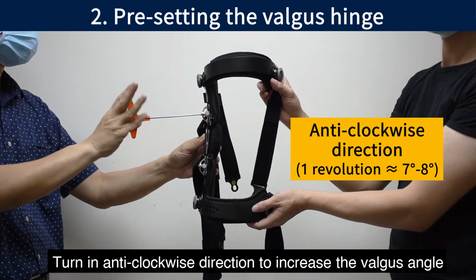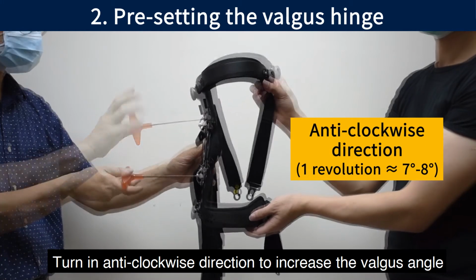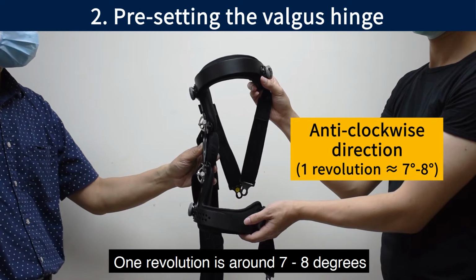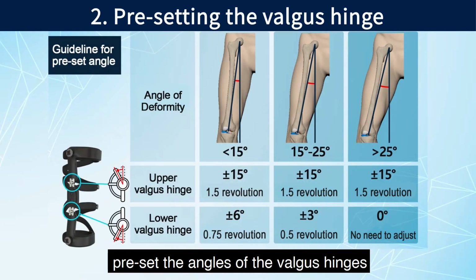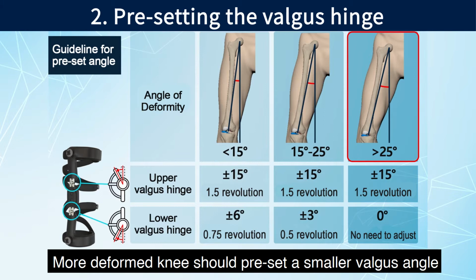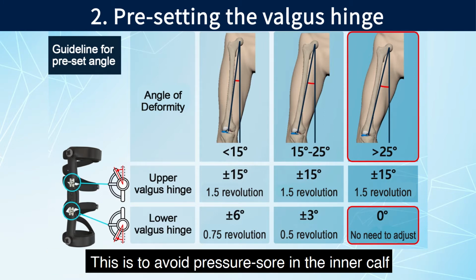Turn in anti-clockwise direction to increase the valgus angle. One revolution is around 7 to 8 degrees. According to the measurement, preset the angles of the valgus hinges. For example, less deformed knee should preset a larger valgus angle. More deformed knee should preset a smaller valgus angle. This is to avoid pressure sore in the inner calf.